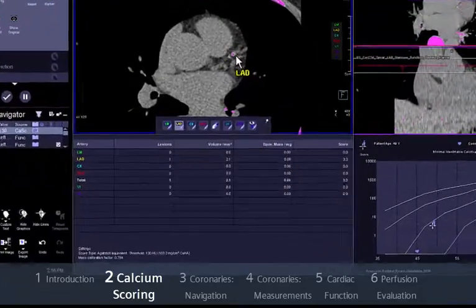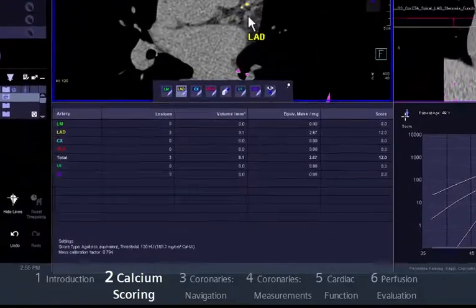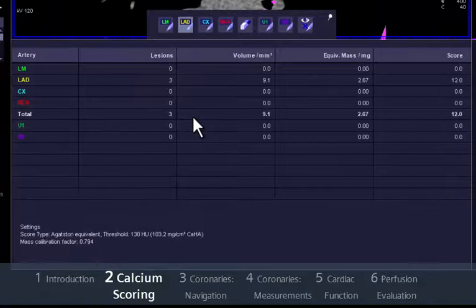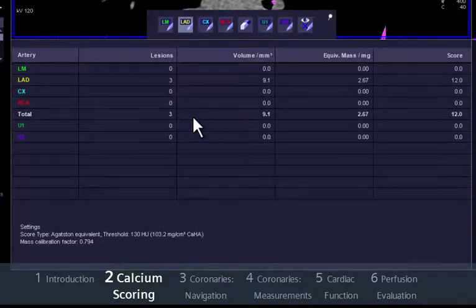The score table is automatically updated. It provides a comprehensive analysis of the number of lesions, the calcium volume, calcium mass and the Agatston equivalent score.